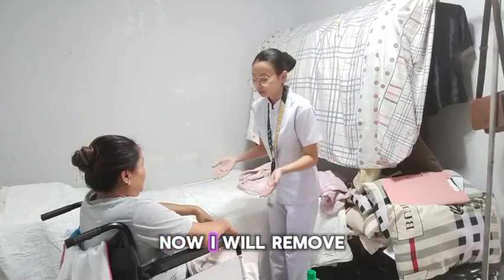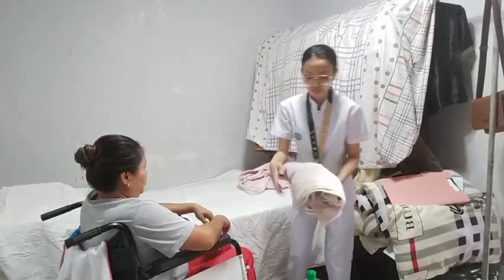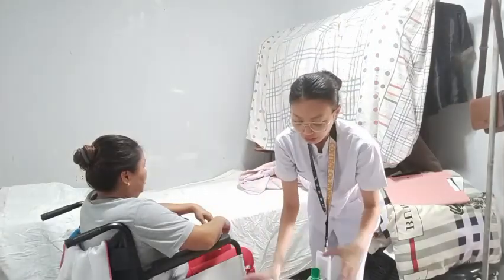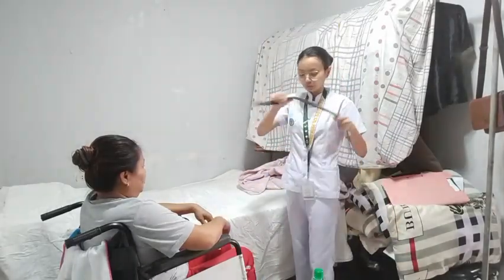After that, now we will remove the blanket from your lap. And now I will put on the gait belt.